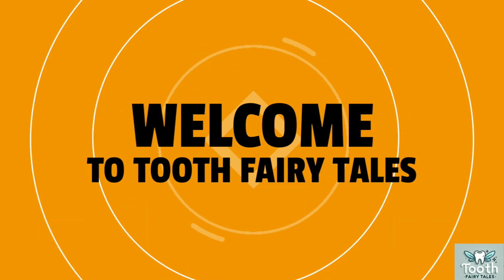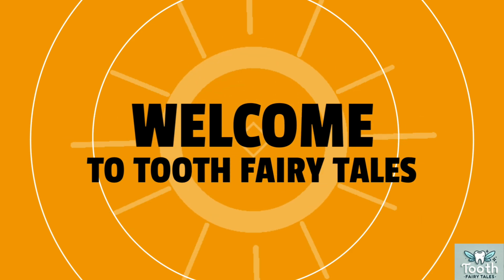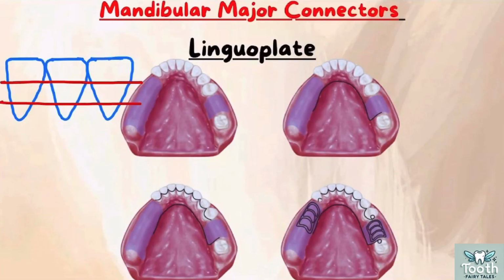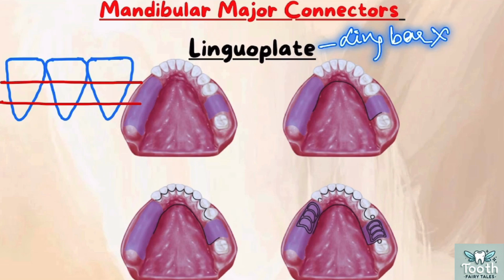In part 2, we have discussed about lingual bar. In this video, we will be discussing about the lingual plate. Next is lingual plate mandibular major connector. Lingual plate is indicated in cases where the lingual bar cannot be accommodated.